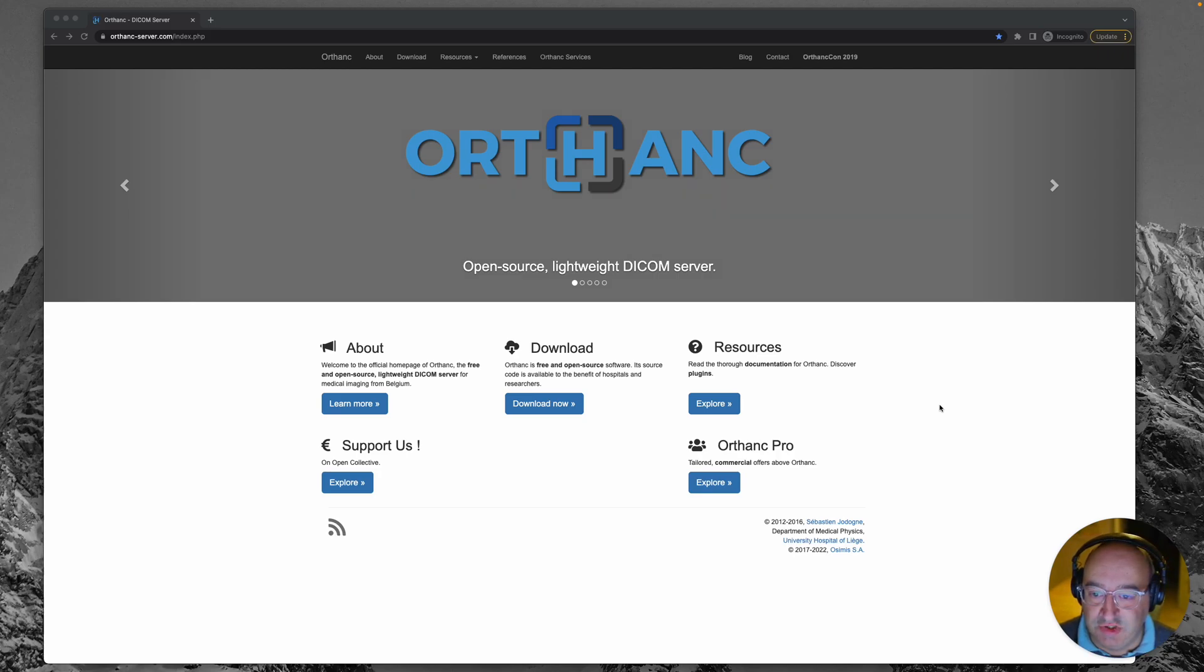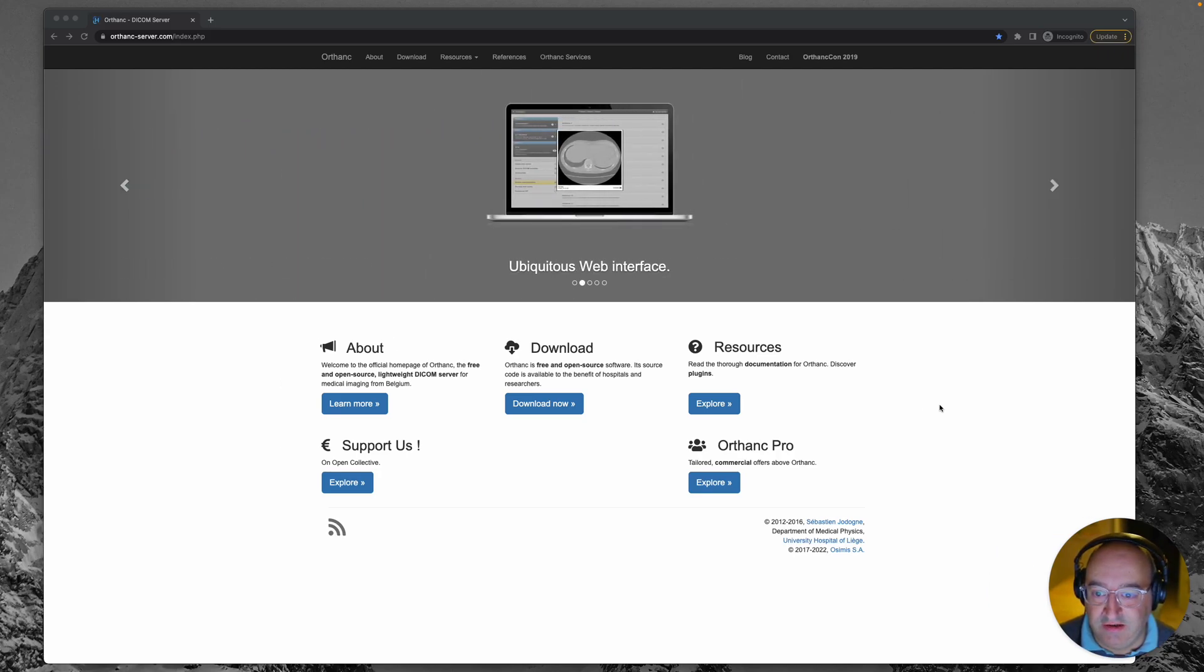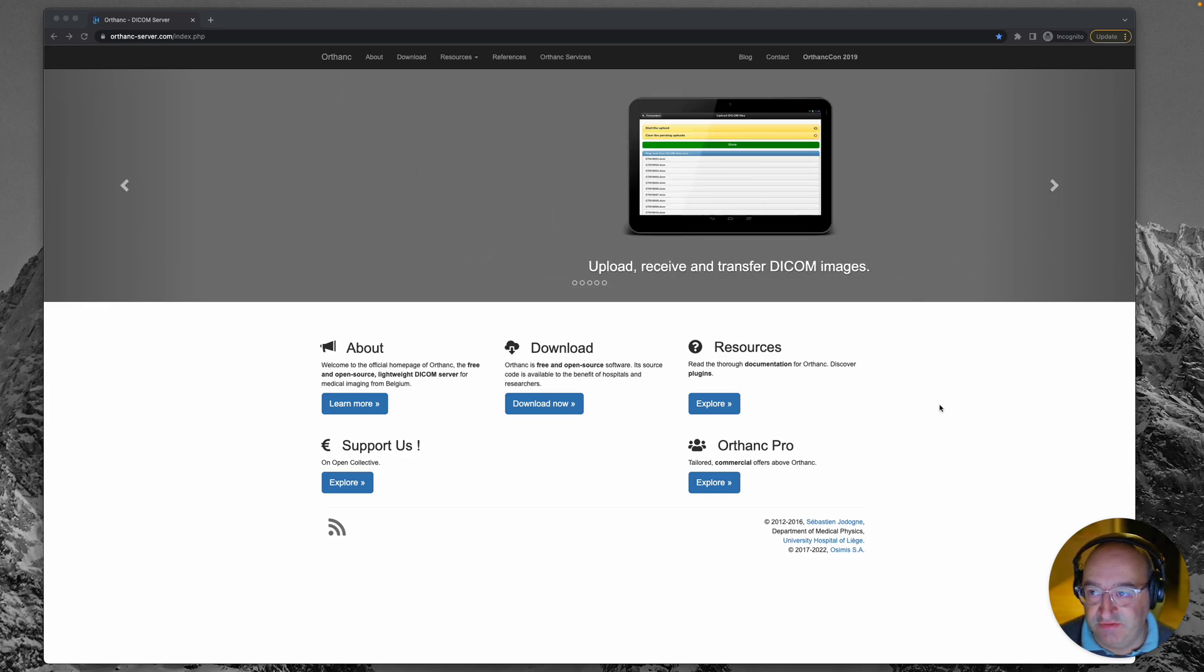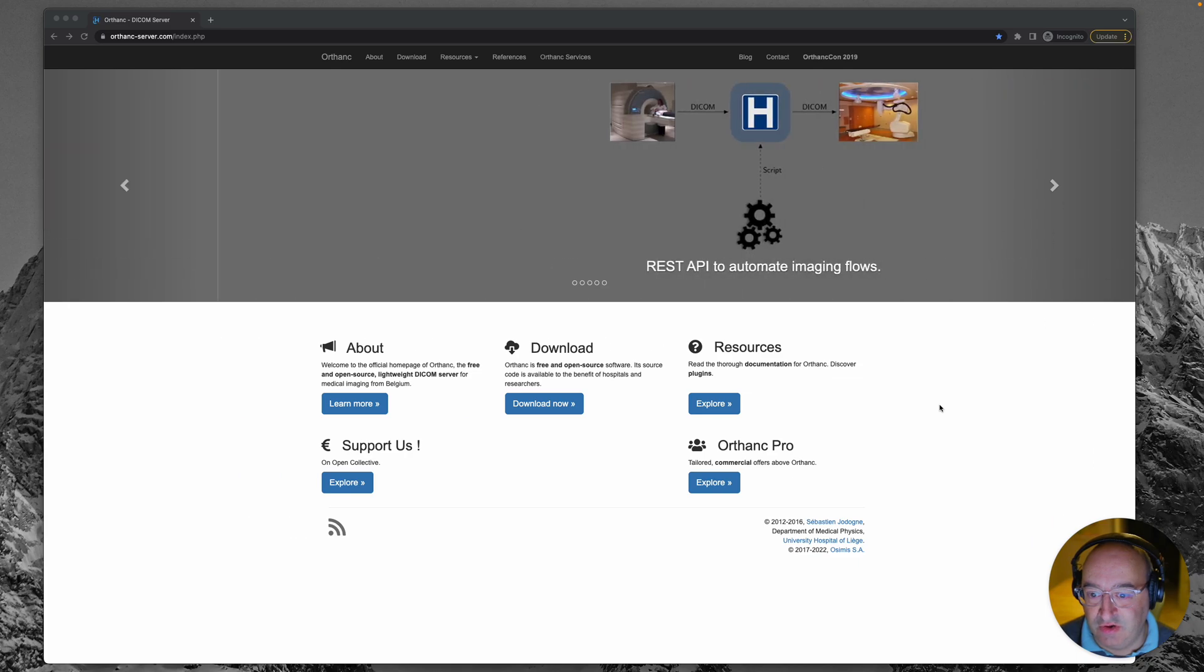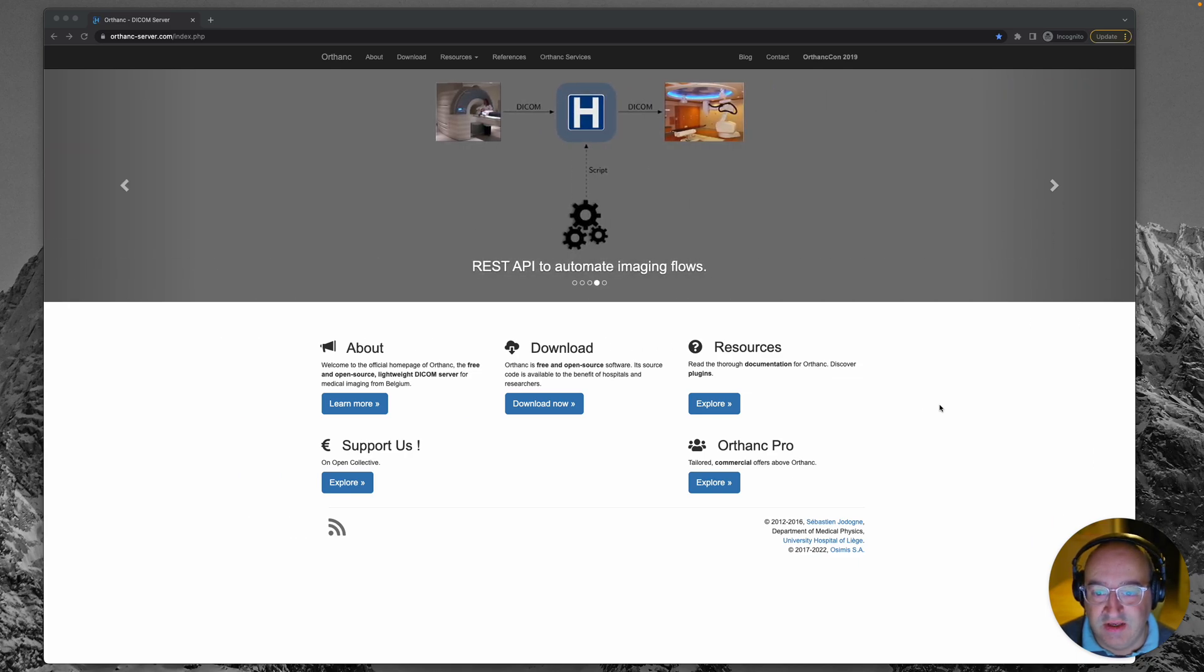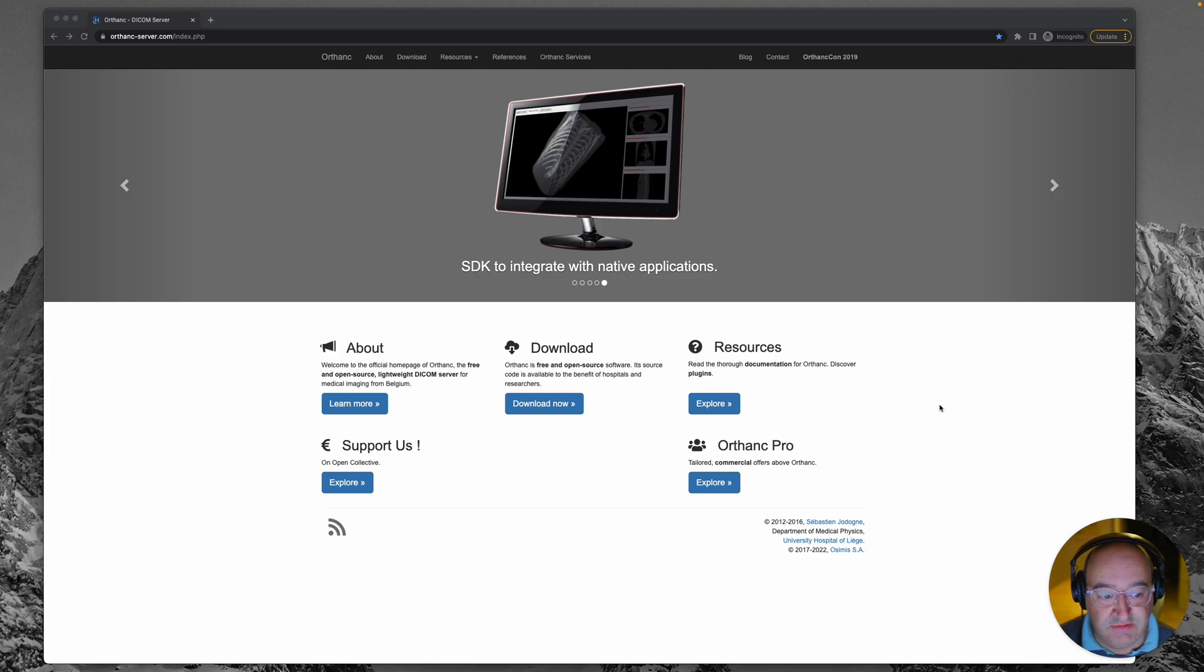Hey there and welcome to my short series on Orthanc. Orthanc is an open source PACS server which you can find at orthanc-server.com. It's free and open source which means that you can put it to many uses.